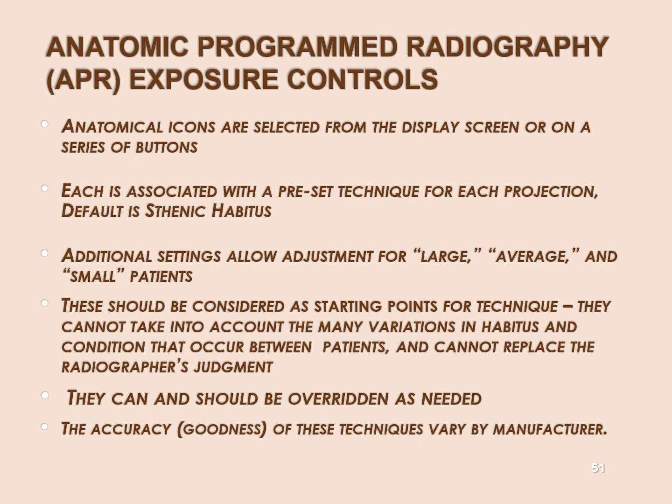Typically where I find the pre-programmed APR techniques fall apart is at the very extremes of habitus, either the extra large habitus or the asthenic habitus or the pediatric patient, which is essentially a tiny adult. So that's APR. There's not a whole lot I can tell you about it in the book that you don't already know. So if you're setting techniques out there in clinical education, you're already using the APR.